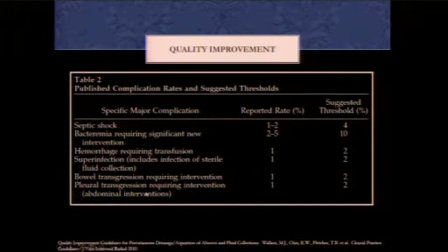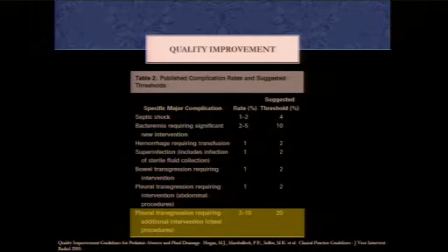So this pleural transgression, they're talking about abdominal interventions only. They don't actually specify this in the adult guidelines, but in the pediatric guidelines, they talk about pleural transgression requiring additional intervention for chest procedures. So this would be placement of a chest pigtail catheter after to drain your pneumothorax. This is obviously going to occur more frequently, at a rate of 2 to 10%, and they recommend a threshold of 20% before you start looking at what could be going wrong in your department.